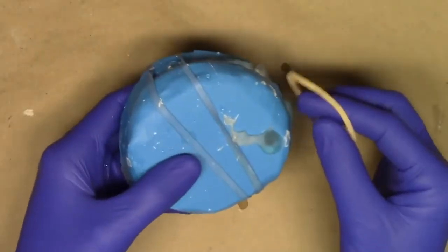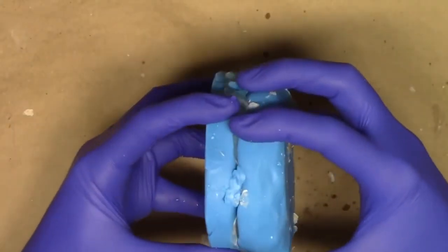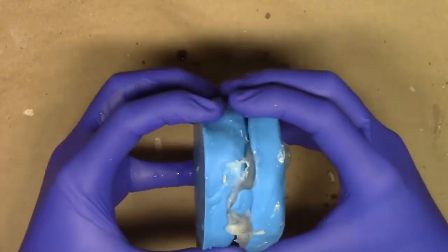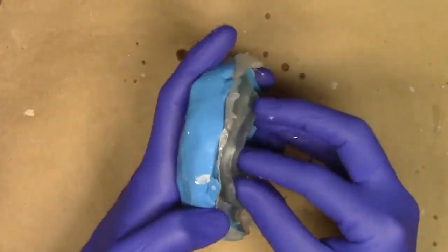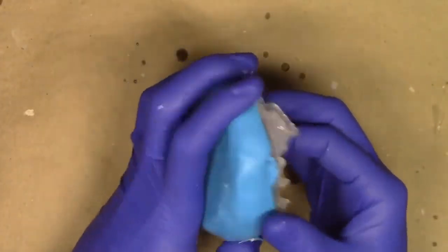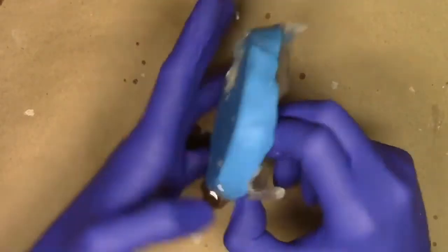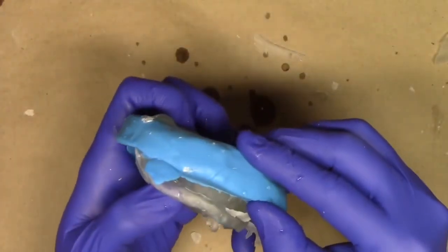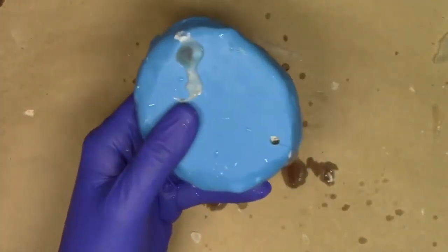Now at this point, when we remove our putty from the pressurized flask, we can remove the rubber bands and very carefully separate the putty, giving us a pretty good idea of our duplicate. Now the maxilla won't usually, or excuse me, the top portion won't usually come off easily just because you have those little vent holes. However, you can pop these parts apart, and what you sometimes have to do is take an instrument and burr off the top portion here.